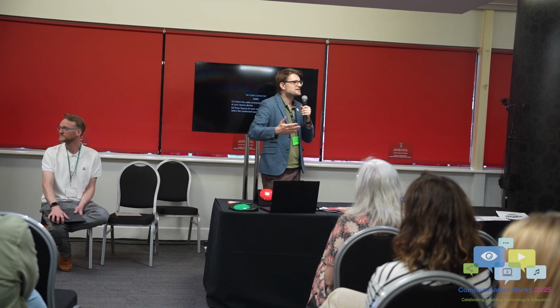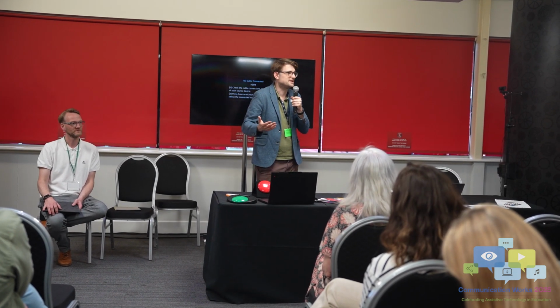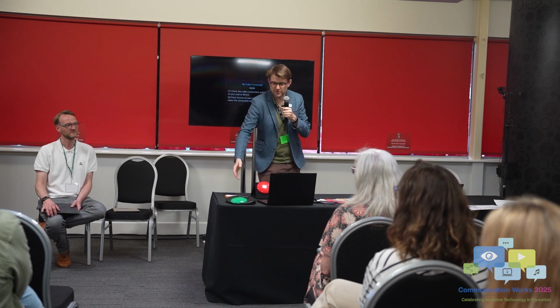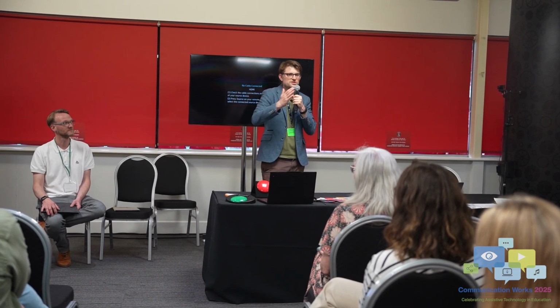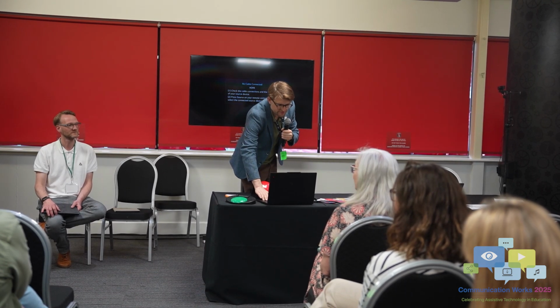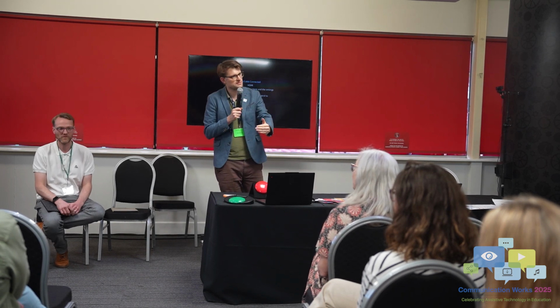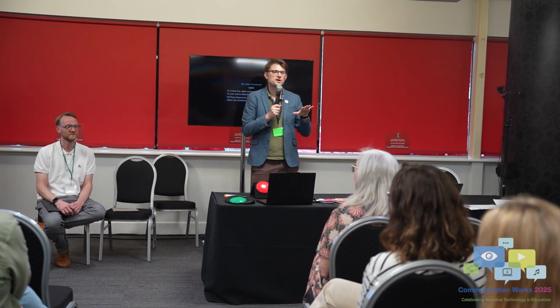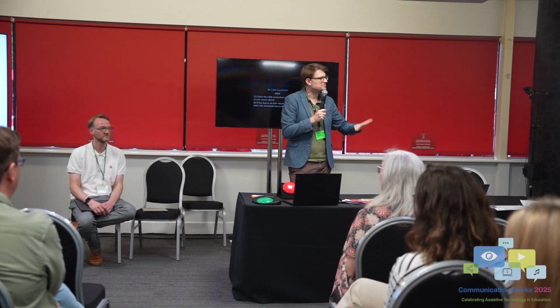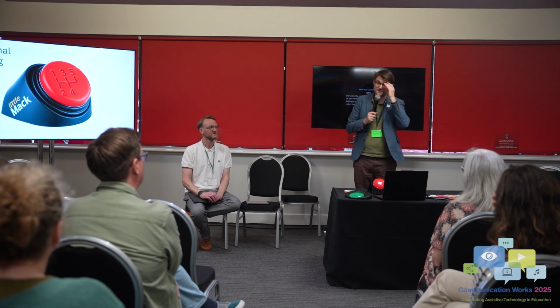The reason why you need scanning is because often there's going to be a lot more options than you have switches, right? So if you want to use the alphabet, that's at least 26 options, but you've only got 1 or 2 switches. So you have to scan through all the options and press the switch when you get there. This, for some people, is a bit of a challenge to scan, but what they can do is start by pressing the switch to make things happen, like pirate ships going sailing by or something like that.